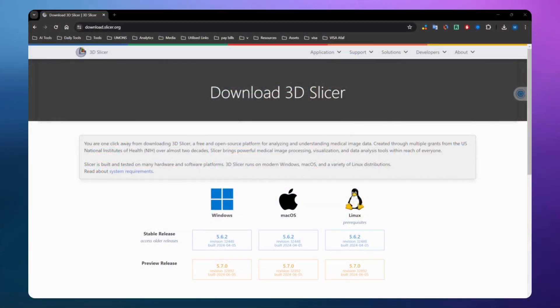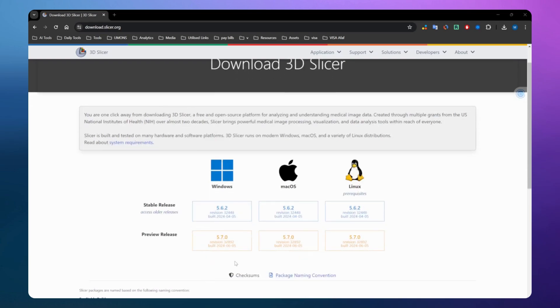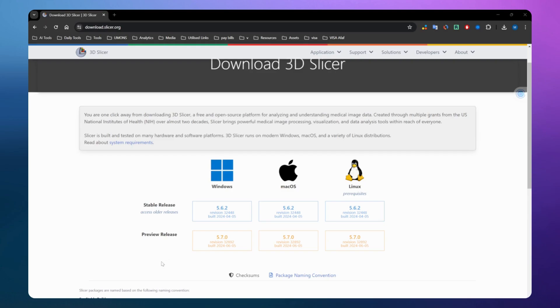The first thing you need to do is install 3D Slicer if you don't already have it, or if you have a version less than 5.7. At the time of recording, the latest stable release is 5.6.2, but this version will not work, because to use NNUnet there is an extension in 3D Slicer called NNUnet Slicer, and that extension is not available before version 5.7.